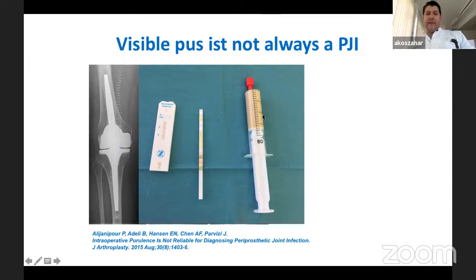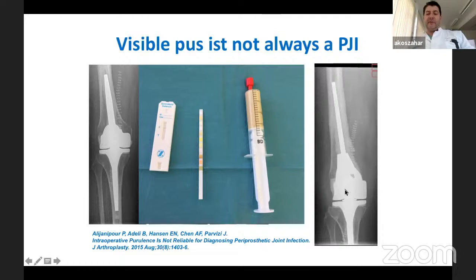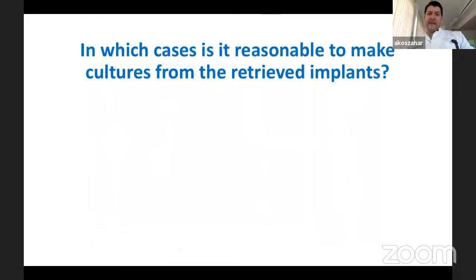We did an aspiration, and you can see it's like pus, creamy pus. But leukocyte esterase was negative, Synovasure was negative, and culture was also negative. So we went for aseptic revision on the femoral side, not septic revision, because it was not an infection but a granulomatous reaction to the cement or some other reaction. We did a revision on the femoral side with trabecular metal cones and a hinge implant. Sometimes you have creamy pus like this in the joint, and it's not an infection. It's very seldom, but it happens.